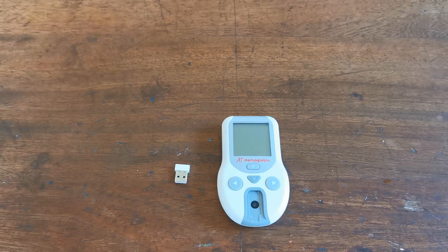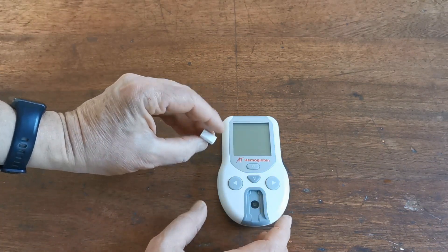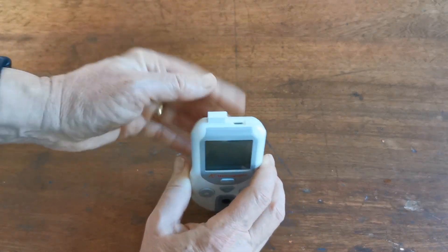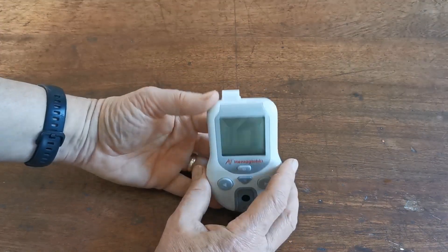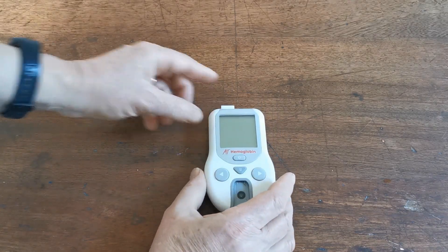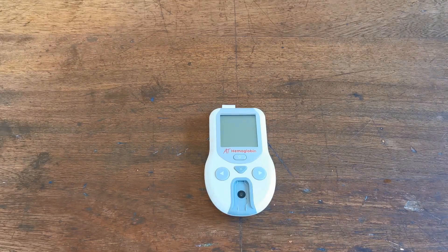There's one final element of your meter setup, and that's to insert the code calibration chip supplied with the test strips. That is now holding the calibration for the test strips that are supplied, and we are ready to do our first test.